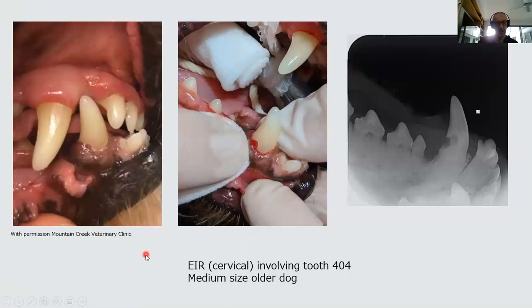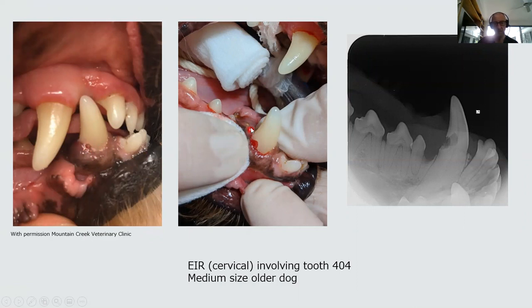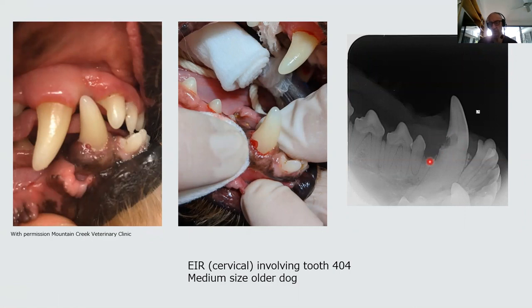Here's a case of inflammatory resorption occurring in the cervical area of a canine tooth. Clinically there's pinpoint inflammation visible in this area. When a small envelope flap is raised, a large resorptive lesion is revealed. The radiograph shows the full extent of the resorption — the lesion is large and entering the pulpal tissue, requiring extraction of the tooth.